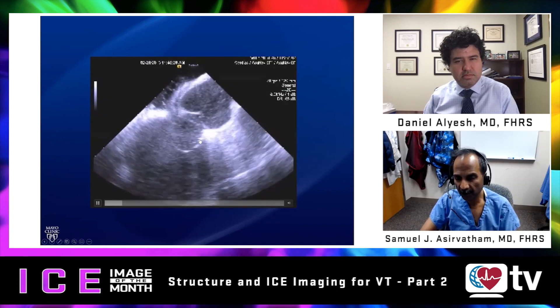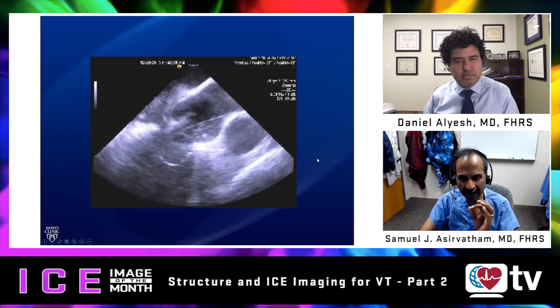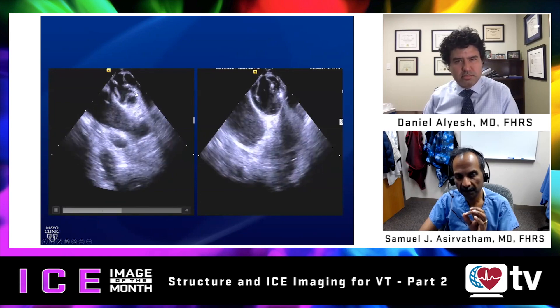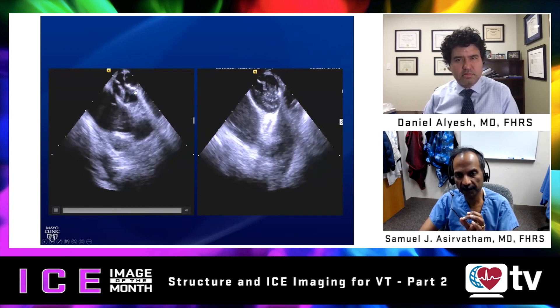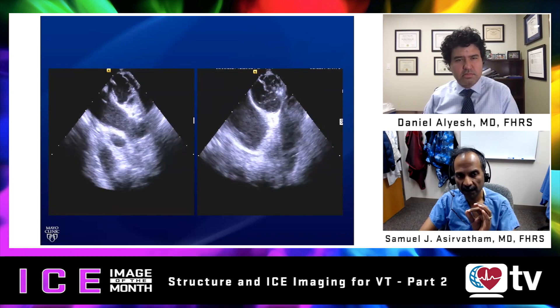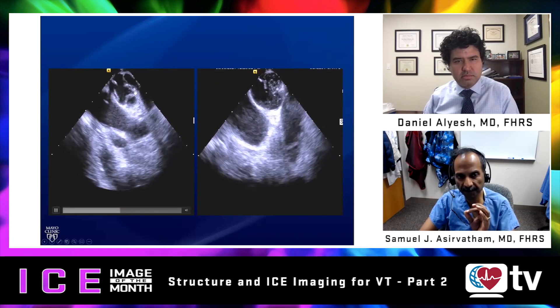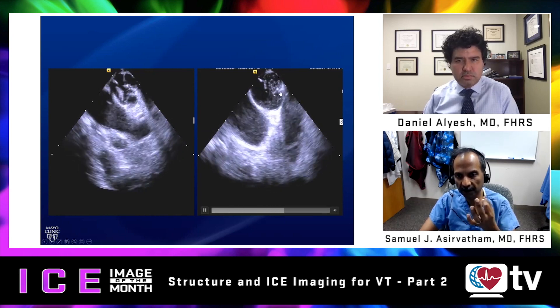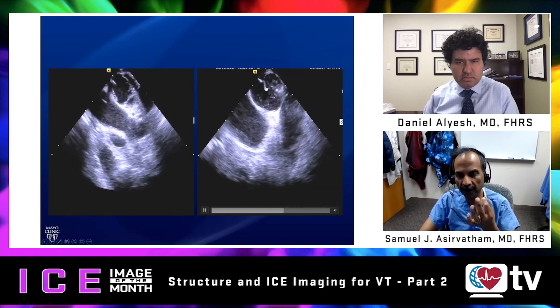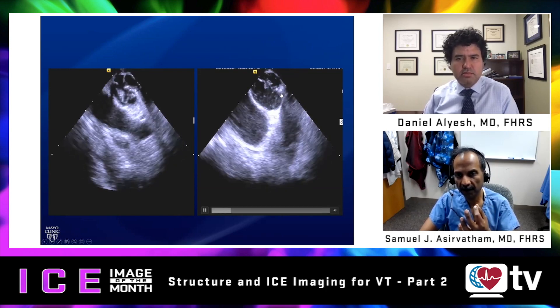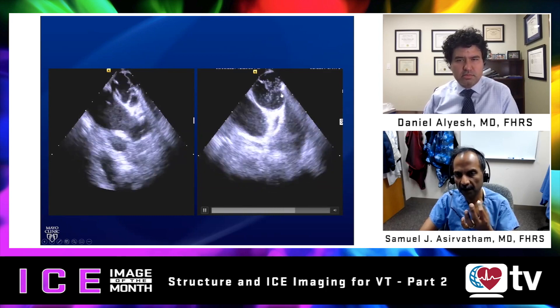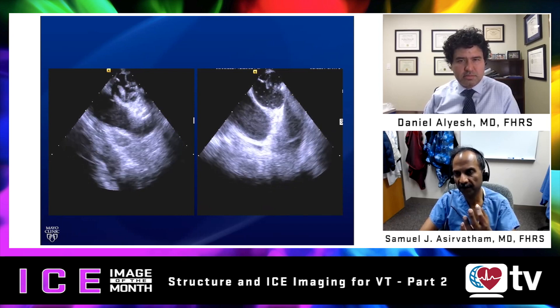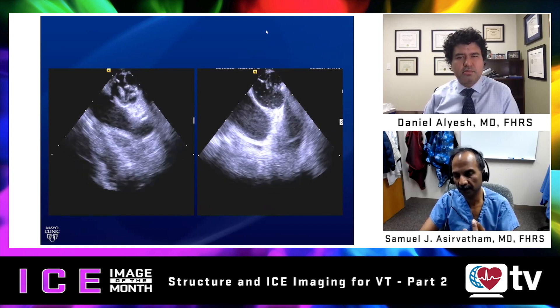Sometimes we don't want to be above or below, but at the commissure level itself. That can be done by prolapsing the catheter in the commissure. It can be tough in real time to know whether the tip is at the commissure or just the shaft — so using a high-flow flush transiently to see where the bubbles come out will confirm that yes, that's the tip at the commissure, where you found the signal of interest and want to ablate.